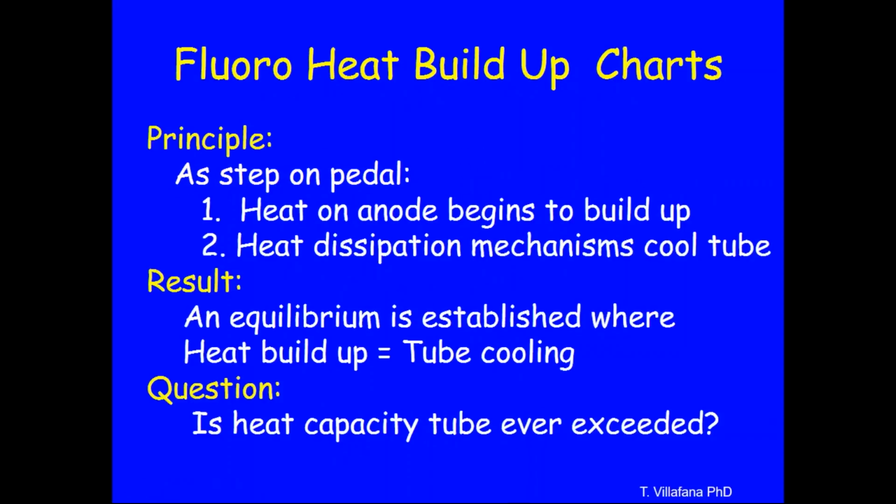Okay, this slide summarizes what I just mentioned, and every machine will seek an equilibrium technique depending on how thick and how dense the patient is, and that then defines the heat buildup. Okay, and let's ask the question: is the heat capacity of the tube ever exceeded?